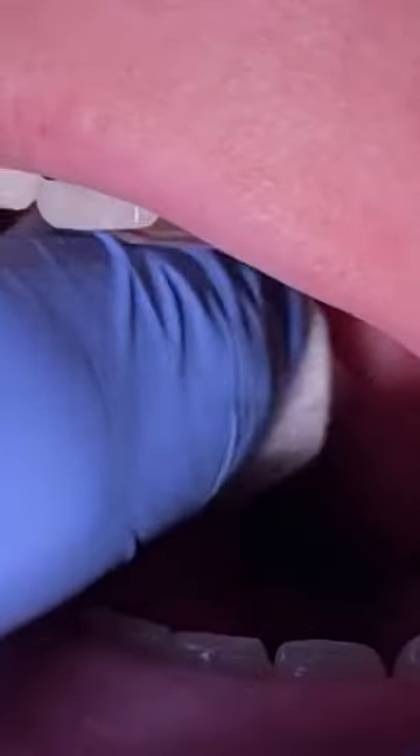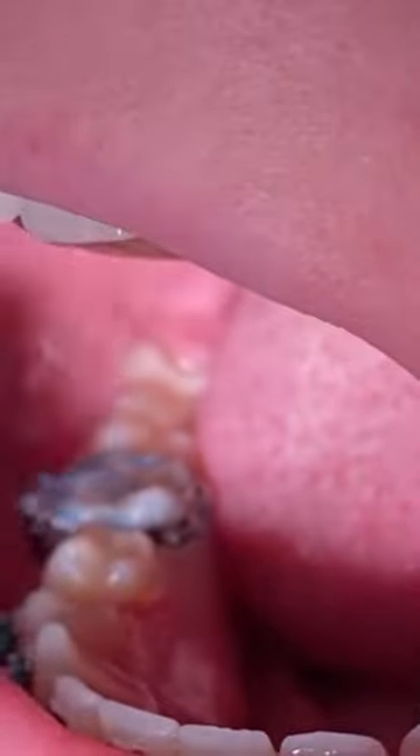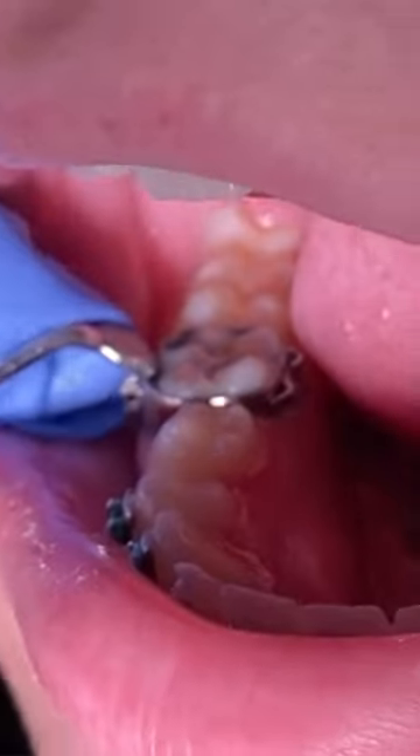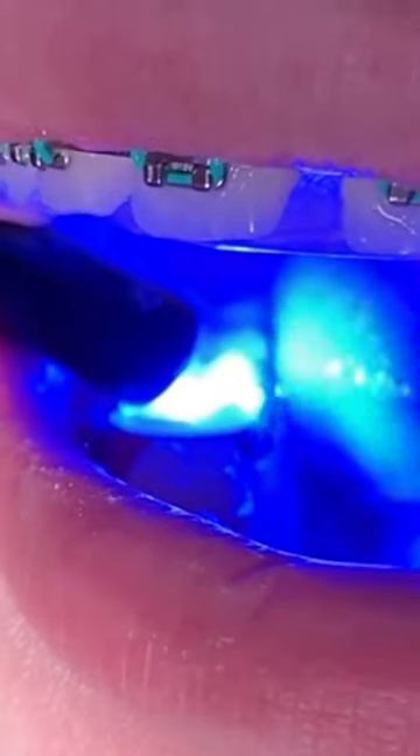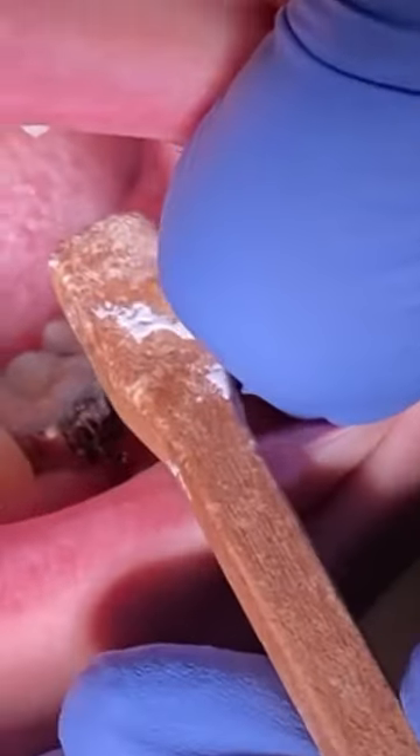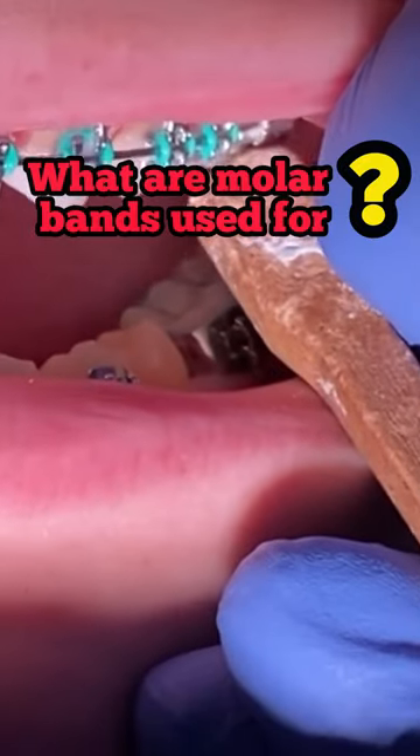After you're done doing that, you're going to go ahead and cement it with what we call Fuji cement, which is the blue colored material here. We'll go ahead and seat it coronal to the tooth, and you can also pair it with some light to just make sure it sets really good.